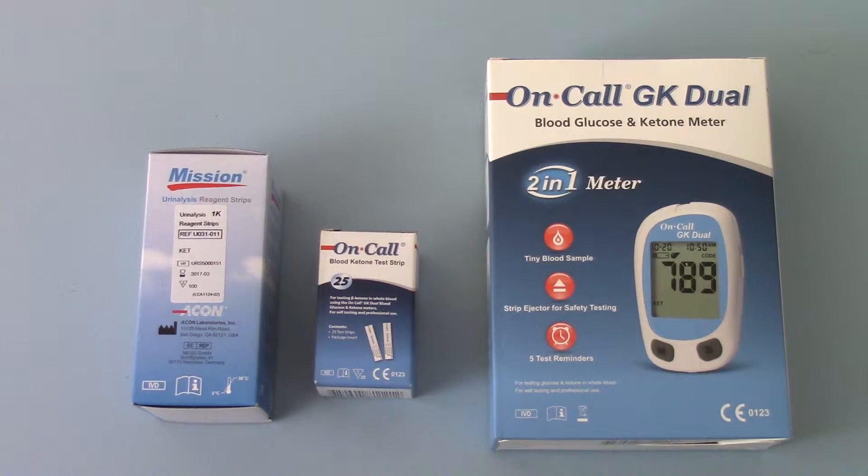They may also dip for ketones to get an indication of whether ketones are present or not. In well-controlled diabetes, occasionally after a heavy or sugary meal, you may have a trace of sugar present in the urine, but there should not be ketones present unless they are running very high glucose levels or have been fasting for a long period of time.